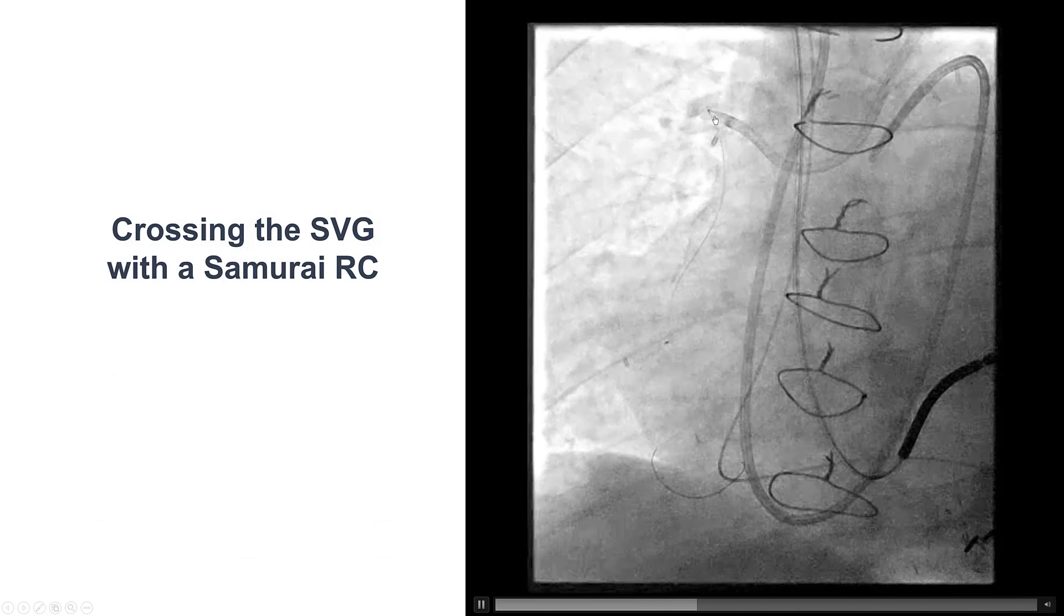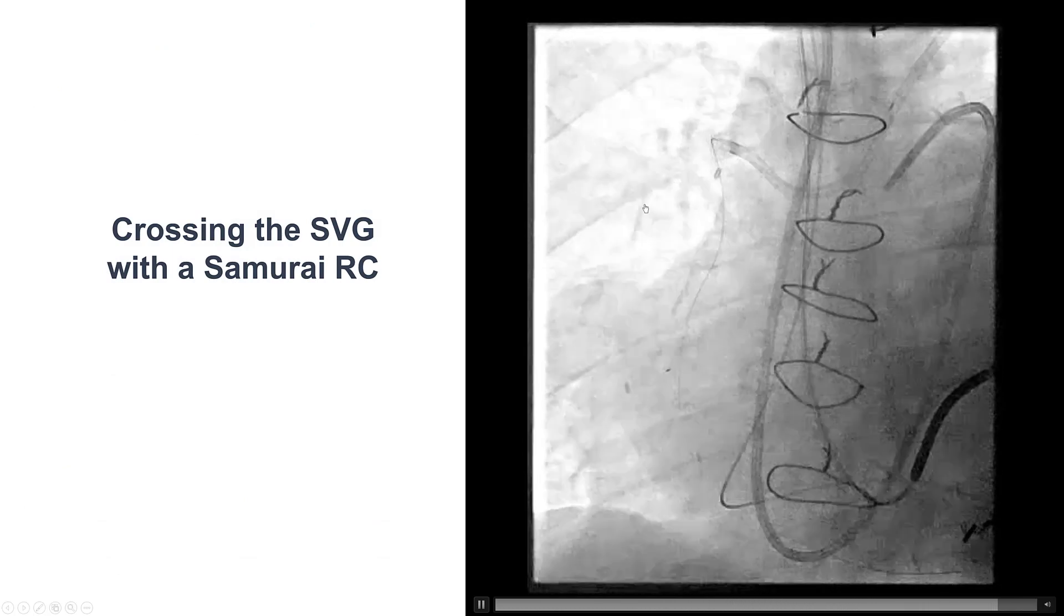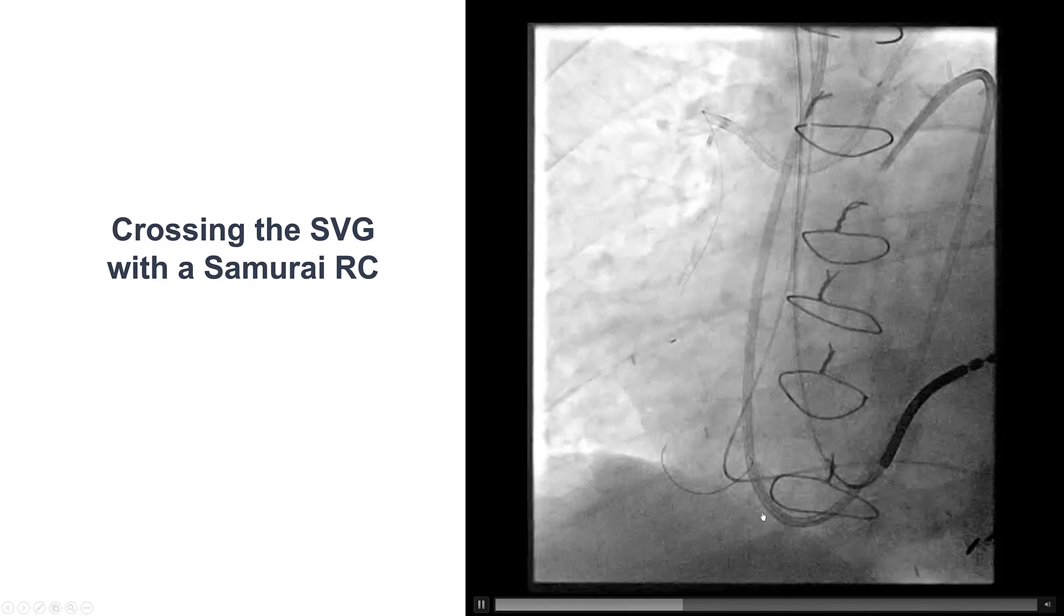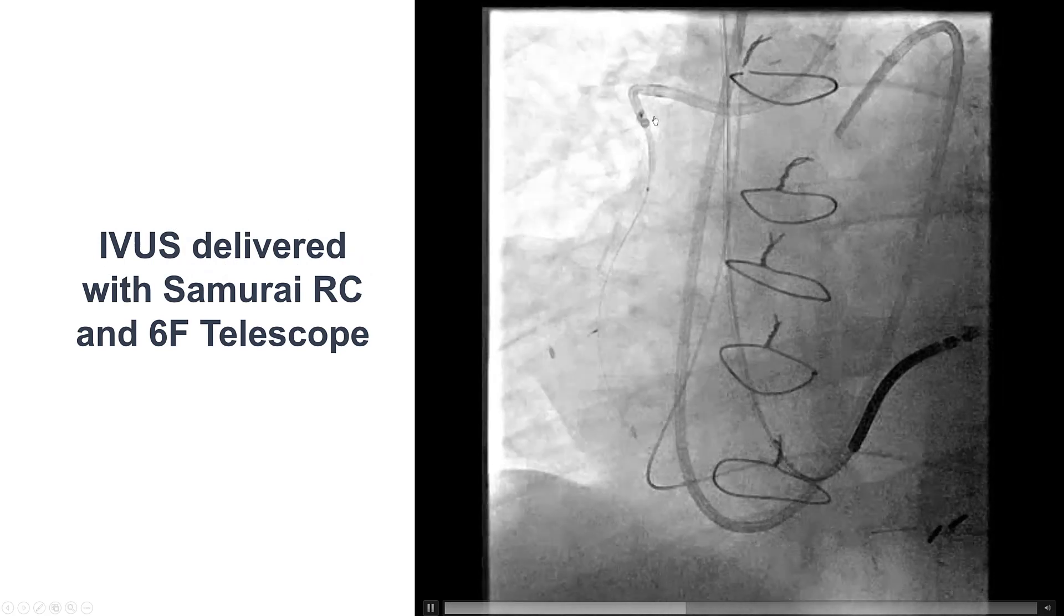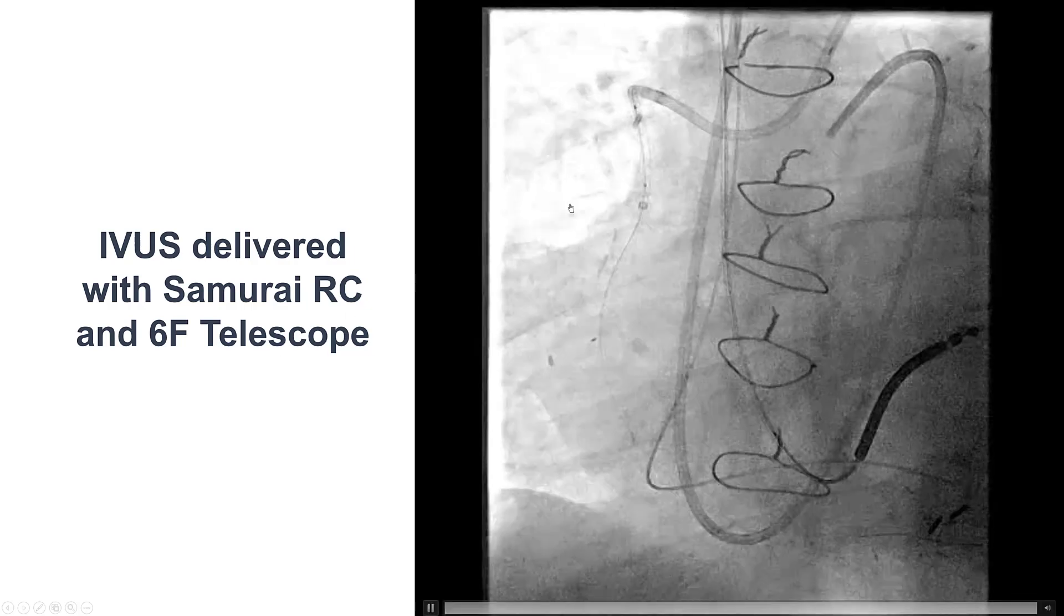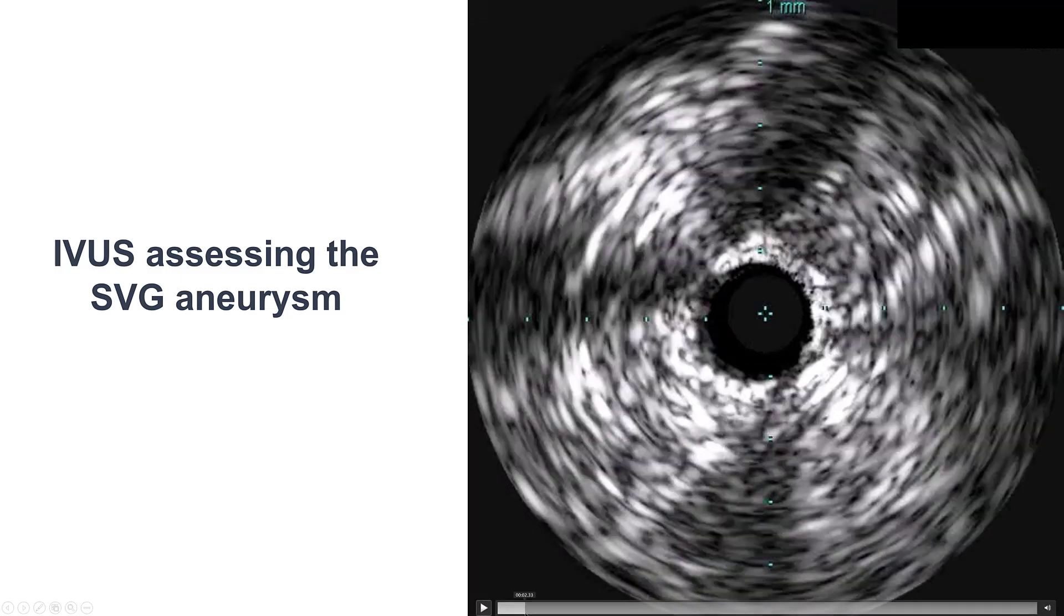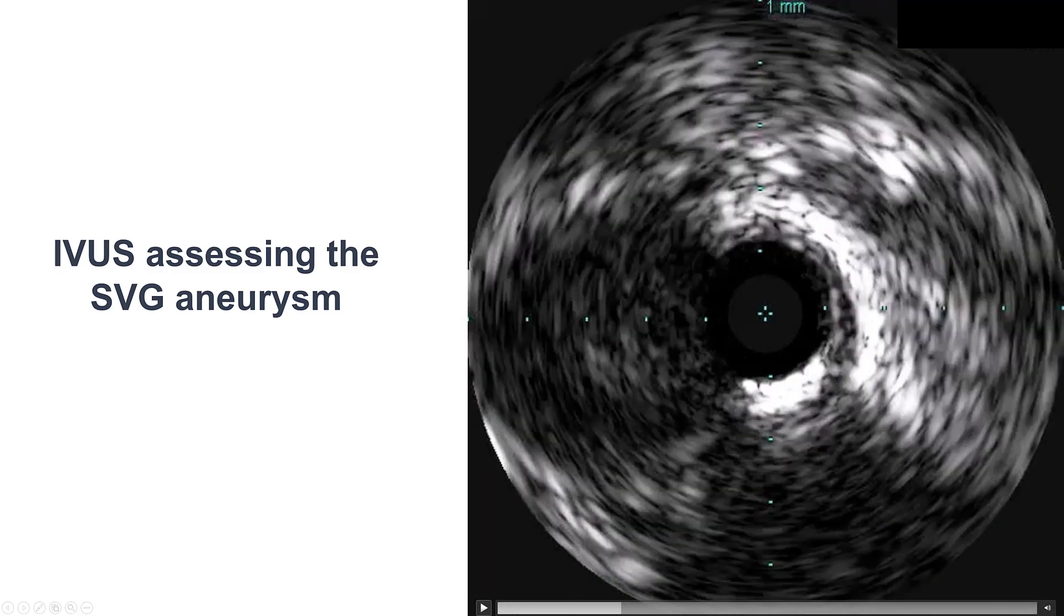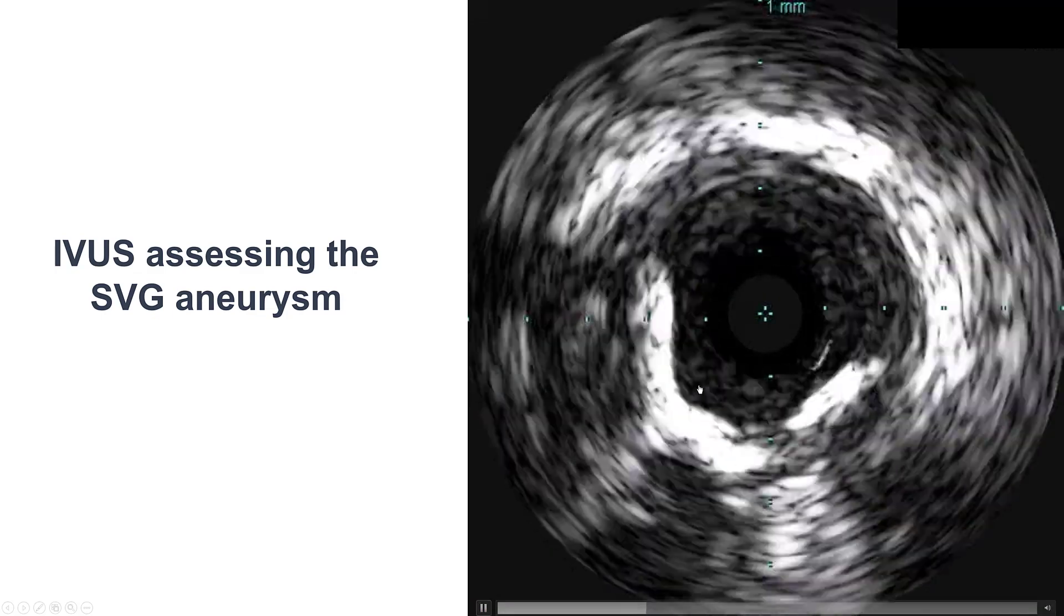Fortunately, the graft was easily crossed with a standard workhorse wire. This is a Samurai RC wire that went through the SVG all the way to the distal right coronary artery. We were able to deliver a guide extension, 6-French telescope, along with an intravascular ultrasound. And these are the images from the intravascular ultrasound. This is the distal native vessel, and then we come more proximal entering into the saphenous vein graft.